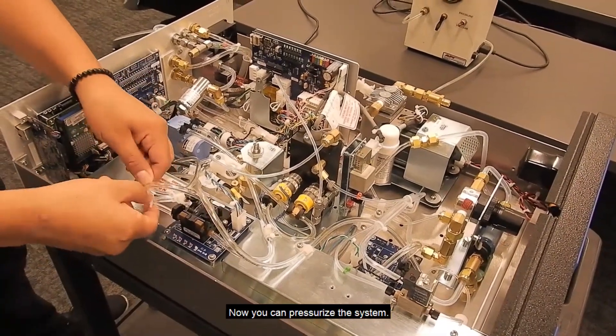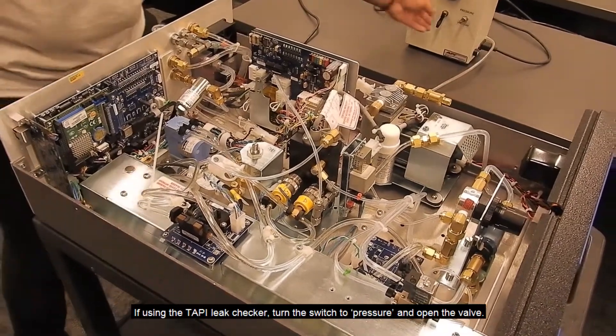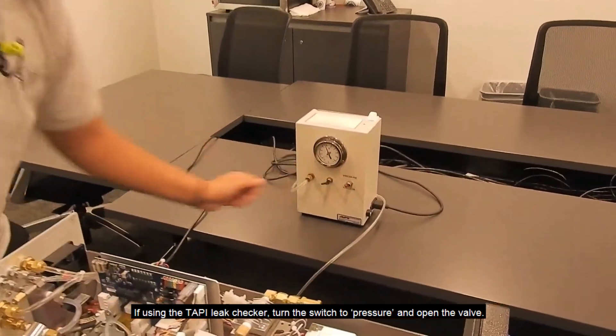Now you can pressurize the system. If using a TAPI leak checker, turn the switch to pressure and open the valve.